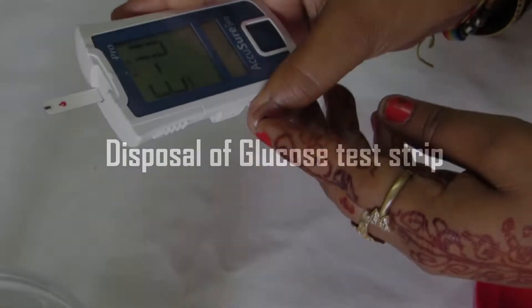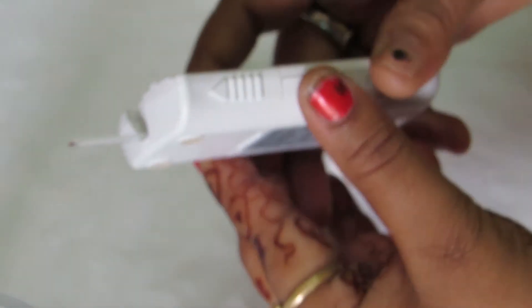Disposal of Glucose Strip. Take the Glauco Machine and at the side you can see a button. Push the button in order to eject the strip.